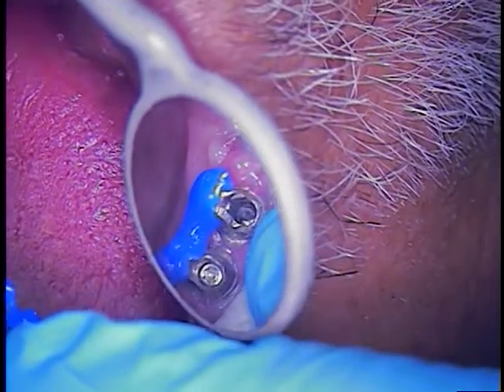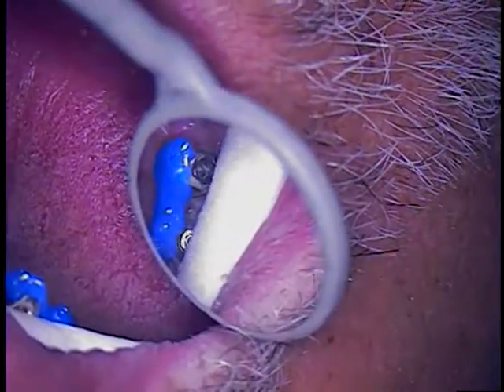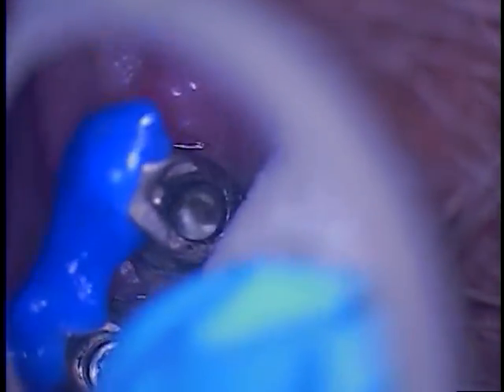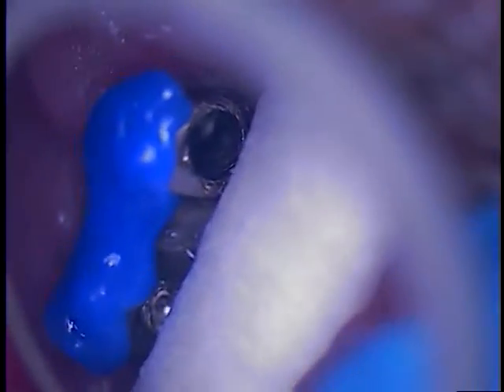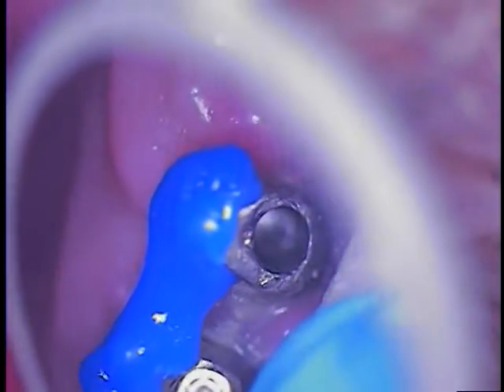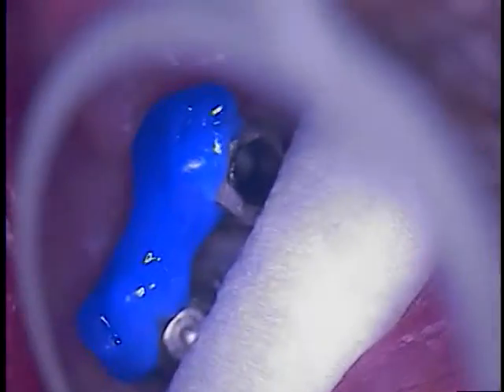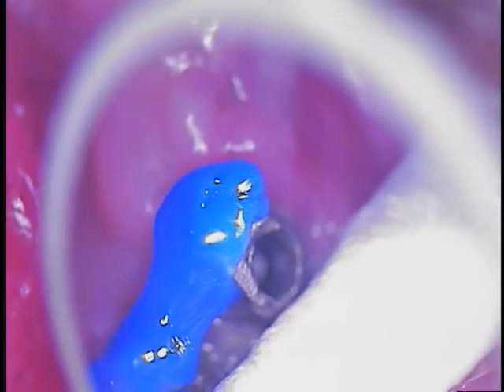And the sides and the wall of the abutment are clean. So all being said, let's take another good close look at everything. It looks good. I always wonder why there are other issues that hold screws in place — it might be something on the wall. But we're just going to lightly hand tighten that in. So we'll take a little break. I'll be back with the final. Dr. Jerry Cuomo — another successful rescue case, about five minutes from finishing.